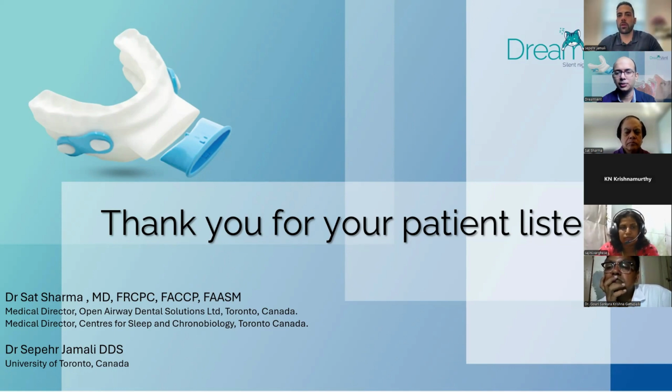These days you can also see there are some websites that do that for you for the ceph analysis, and they also have an airway detection part. So even if you cannot trace it yourself, which is pretty easy, you can also use those applications. But the CBCT is very interesting. It can create a 3D volume of the airway and exactly shows where the obstruction is. And when you put the jaw at the forward position, you can exactly see that.